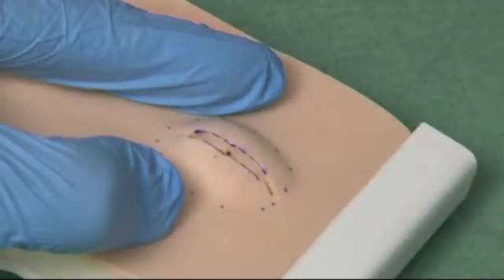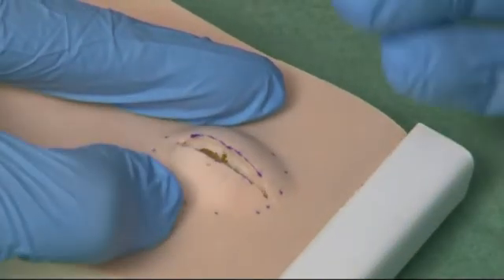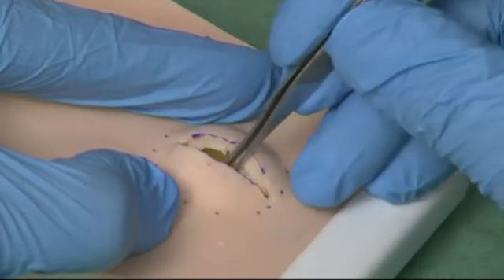As it becomes more mobile, it may be possible to squeeze it out by applying firm pressure, or indeed by pulling out with the tooth forceps.